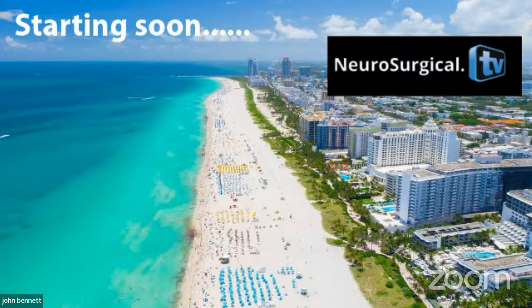Even with an endoscope, I could see it, but I had a difficult time reaching around the cerebellum to resect this part of the tumor. And so you could see at 9 months post-op, that residual tumor started to grow again. You could see it starting to get larger. And so I had to come back with a different approach. If I used the same approach, I would be met with the same limitations.